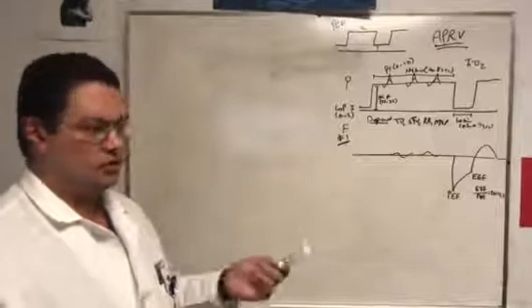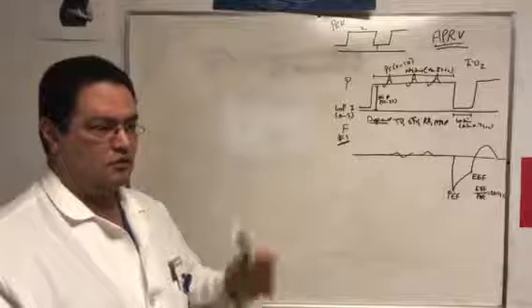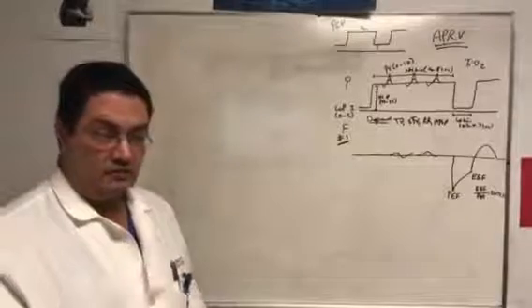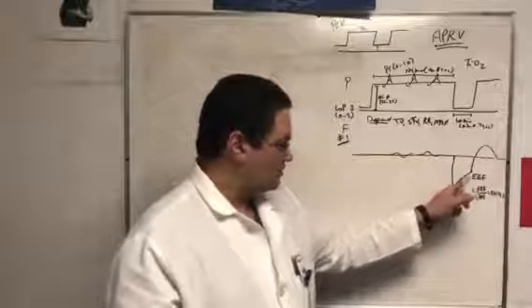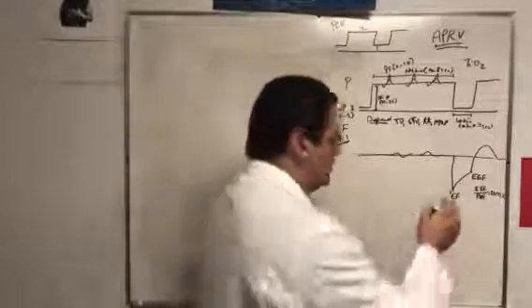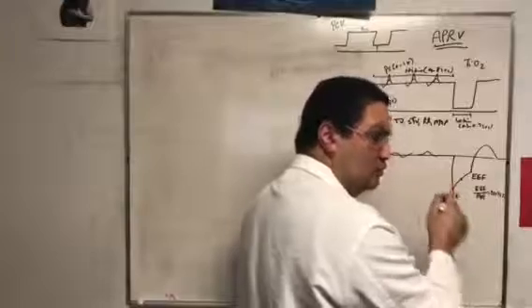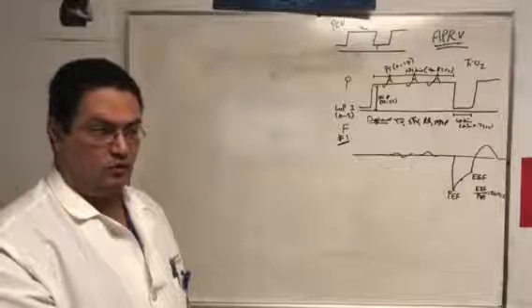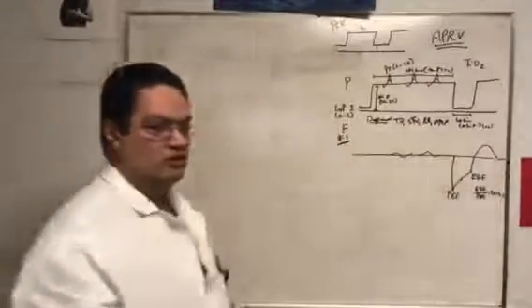So how about if you measured the ratio, and the ratio came out to be 85%? What is happening, and what would you do for the patient? If you look at this curve, where does the 85% exist? This is 100, this is 50, so the 85% is going to be around here, right? So you terminated the breath early. That means you're having more auto PEEP, and this lung is going to have barotrauma, decreased venous return, all of the stuff that happens with bad auto PEEP. What you need to do is prolong the low time, and this will go all the way to 50%, okay?